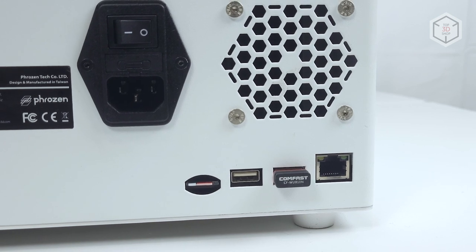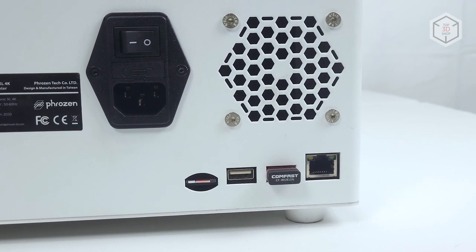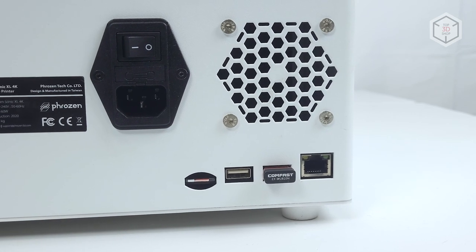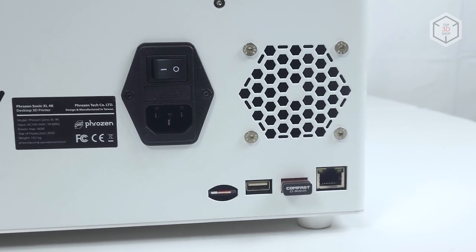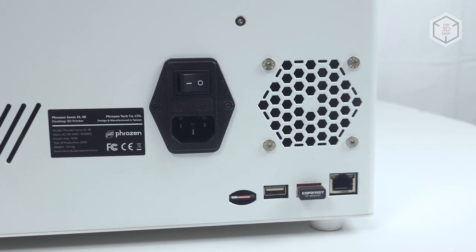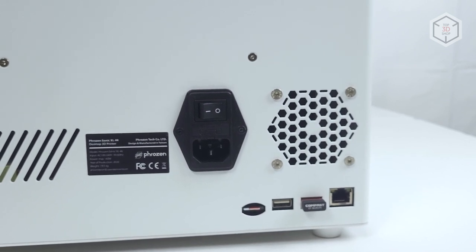A microSD port with a memory card already inserted is located on the left side of the printer. This microSD card is not used for printing parts right off of it. The Sonic 4K XL is powered by an Orange Pi single board computer, responsible for displaying the interface, networking capabilities, and other operating functions.